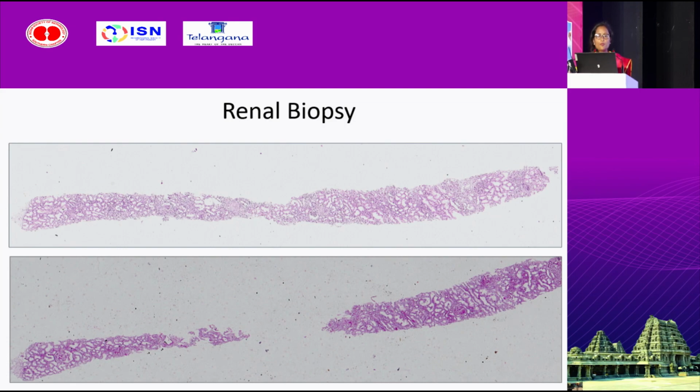So this is the core of biopsy we received, single linear core. It had almost 9 glomeruli and 1 artery. In this magnification, which is 0.8x, we cannot see much, but at least we can appreciate that there's not much inflammation. It doesn't look as blue as when the interstitium shows a lot of inflammation. This is a PAS section. We lost a bit of tissue here. In between, in PAS, we can see some mild patchy tubular atrophy.